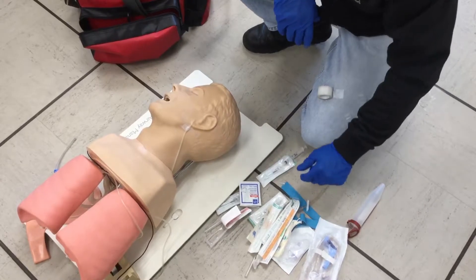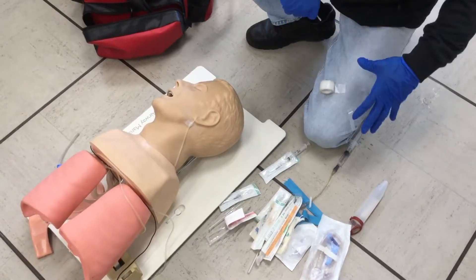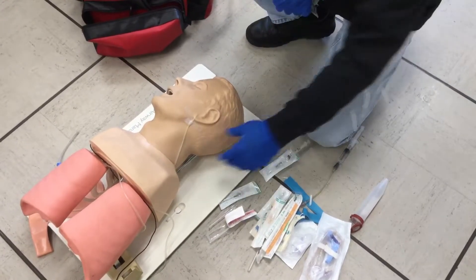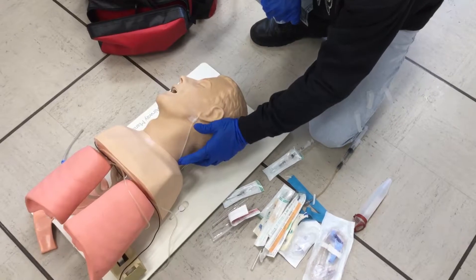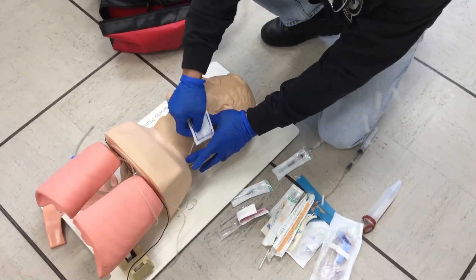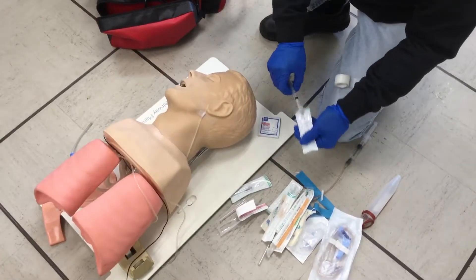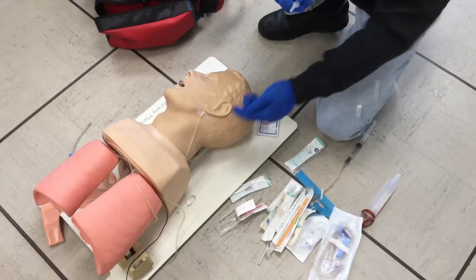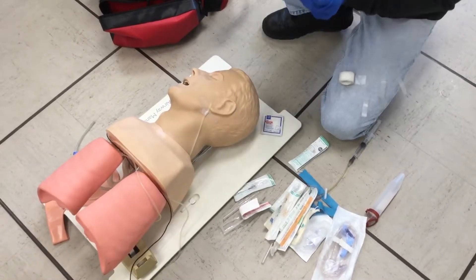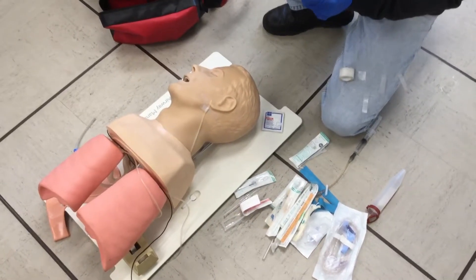Make sure there are no air bubbles inside the syringe at the beginning. Alcohol prep the site. You have your securing material and your flush. Sharp shuttle ready. Tourniquet the area. Stretch the vein out and skin. Clean and prep the site with a circular motion until the area is clean. You know where you cleaned — so that's where you're going to start. You want to start high up in the jaw and not so far down, so that we miss penetrating the pleural cavity space.